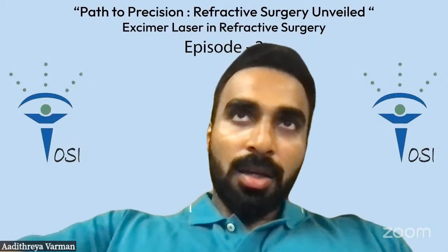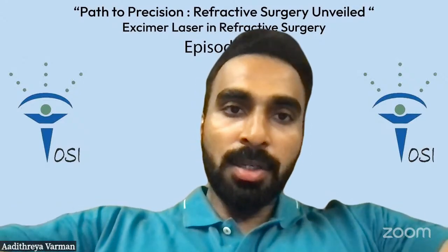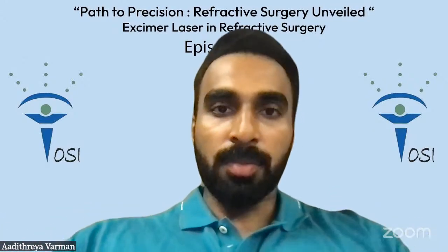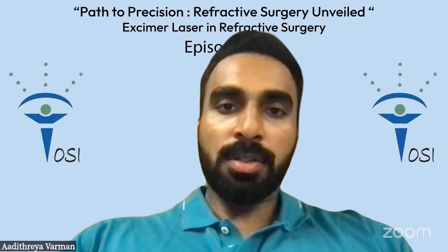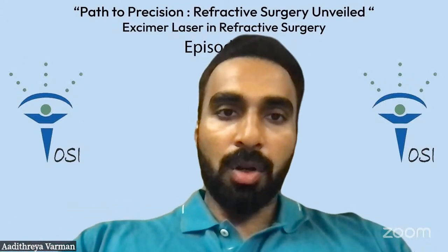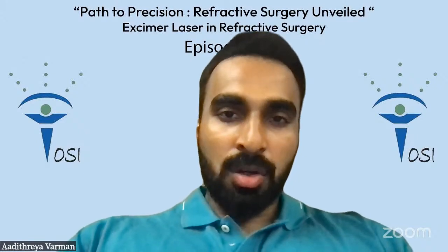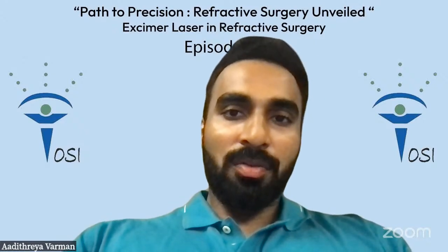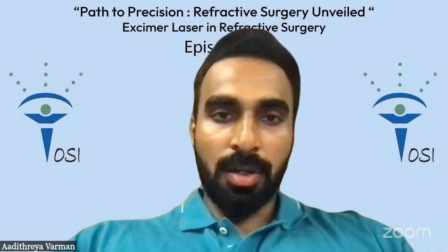Following that, shift the patient straight out of the OT to the slit lamp outside. Outside, I examine them, and then I look for any macro adjustments. If I see the flap is off one way or the other, I macro adjust there because it is still hydrated enough for me to adjust with a Merocel sponge. Following that, they go down and get the vision checked. The vision check is just a gross check, not for vision in particular, but we allow the flap to dehydrate so it starts to position and sit well. Then I bring them to my clinic.